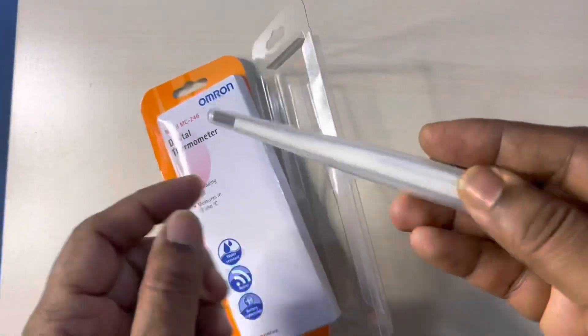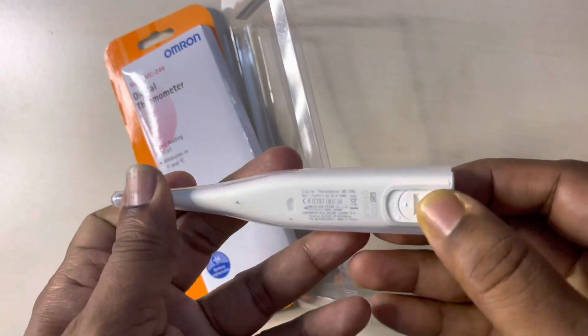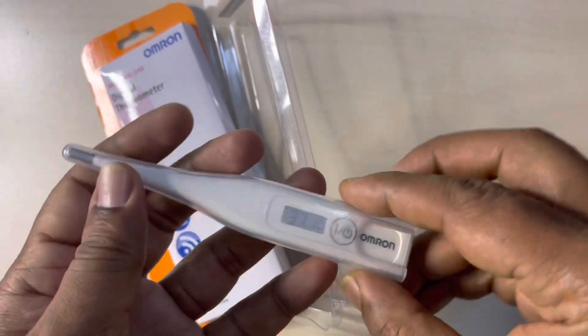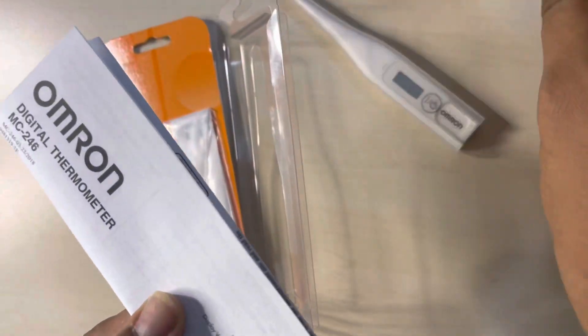This Omron thermometer is for oral, rectal, and underarm usage. It recalls the last reading, measures Fahrenheit and degrees Celsius, the battery is replaceable, and it gives off a buzzer when the temperature taking is finished.